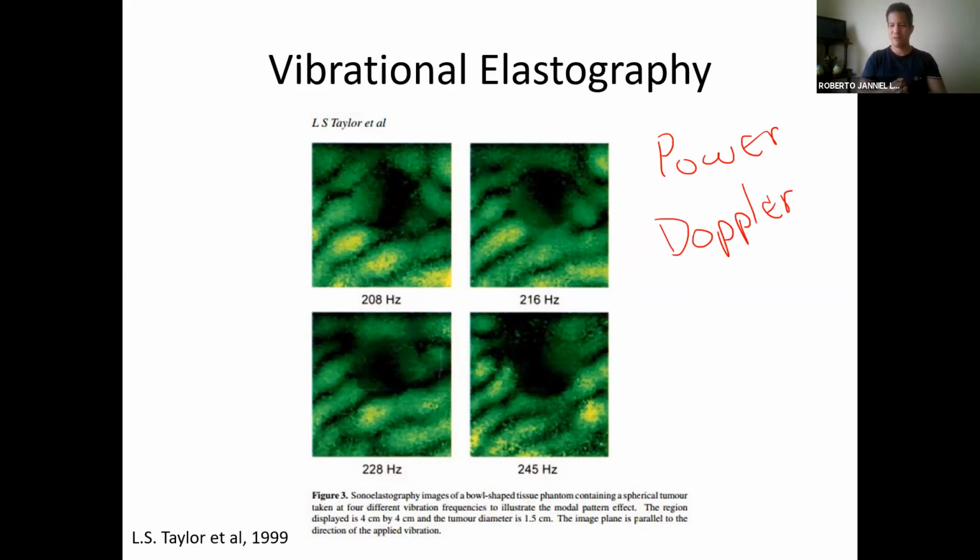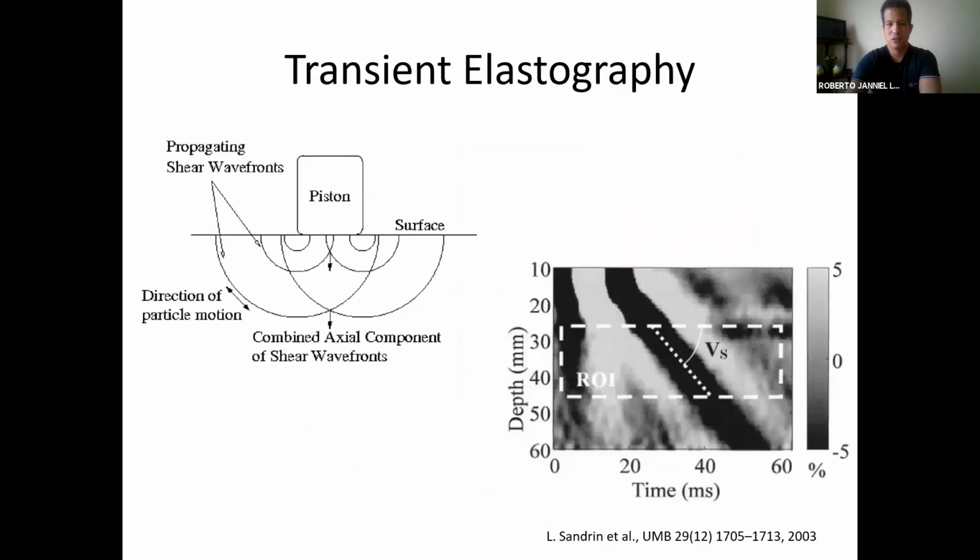It's with the opposite effect, actually, right? Because you're inducing the movement. So it's basically a matter of seeing in which parts you have the strongest movement versus the weaker one, which is related again to how stiff the medium would be. So this is another example of how, even though it's a different technology, the same principles, the same algorithms apply, and they're used in a different way, in this case, to construct elastograms rather than power Doppler images.